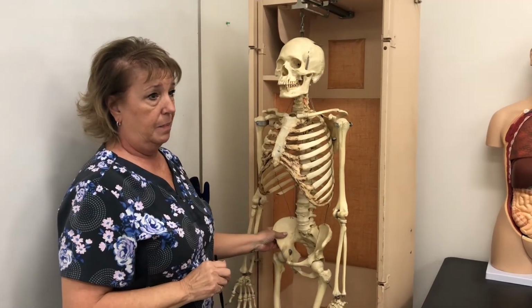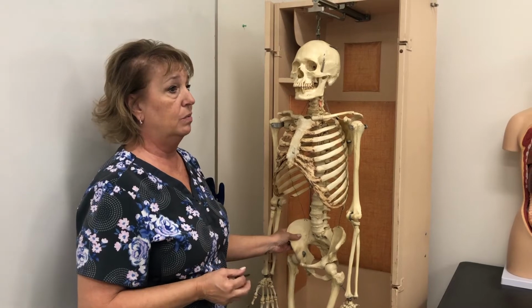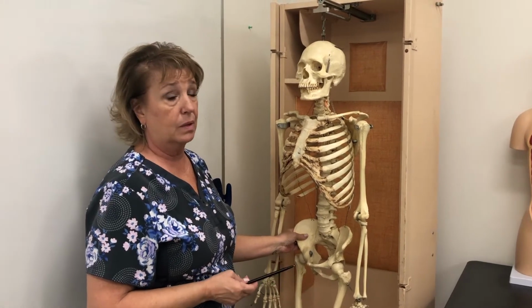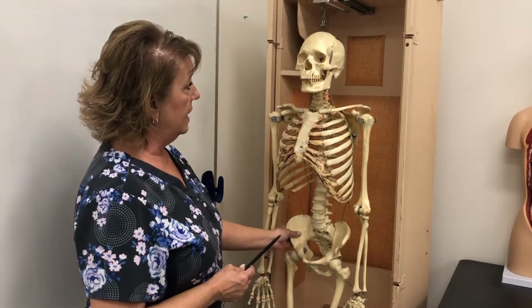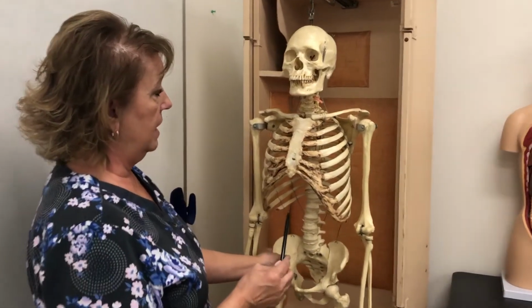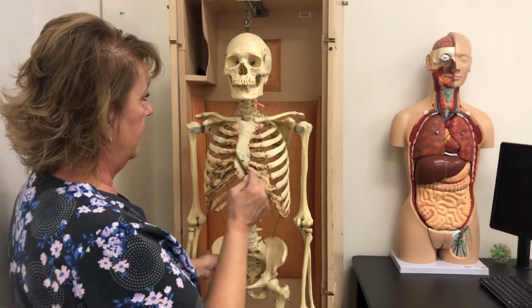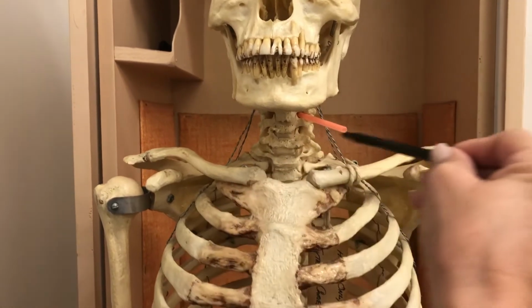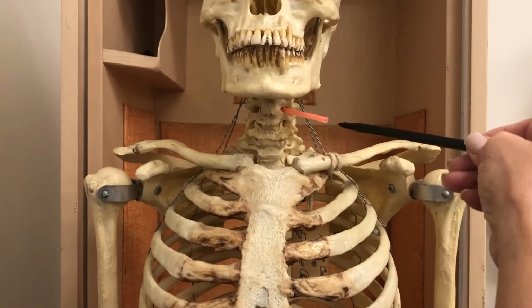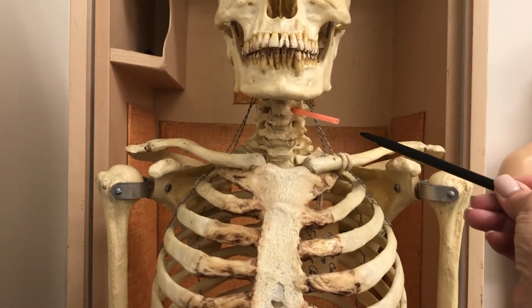Before I demonstrate on the patient, I wanted to show you in effect what we're trying to do with the obliques. It's to open up the cervical foramina, intervertebral foramina. The way they sit in the body is demonstrated by the straw, okay? They are located about 45 degrees out from mid-sagittal plane, and in the AP position, they're down about 15 degrees.